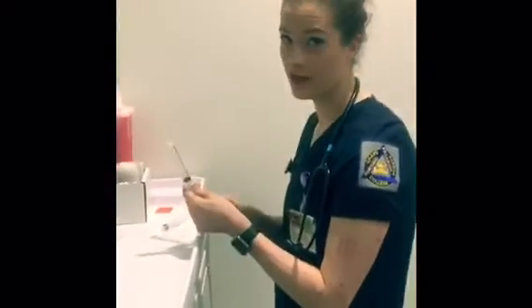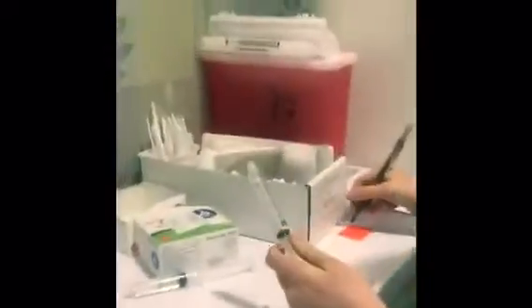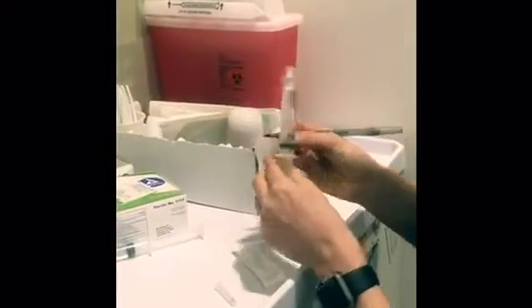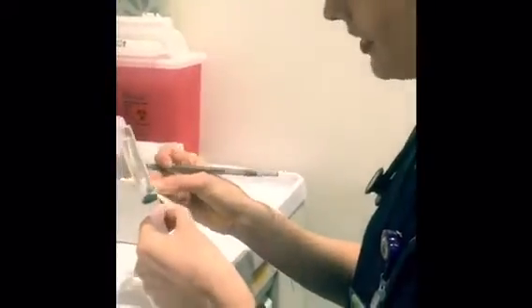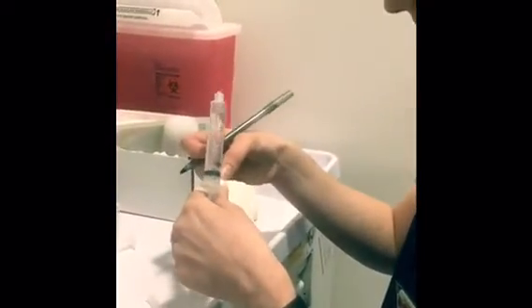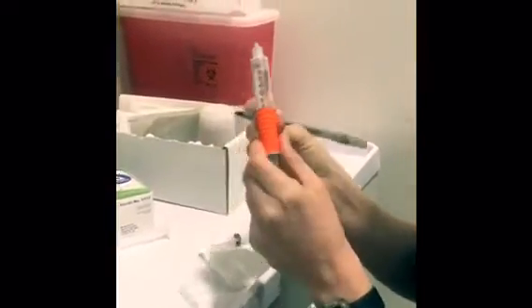Now we're going to label so we know what this med is when we go to give it to the patient. So I'm going to write the medication and dosage, and then I'm going to put it on here. We're not going to put any identifying patient information because in case we get distracted, we don't want that on our patient. Okay, that's labeled.